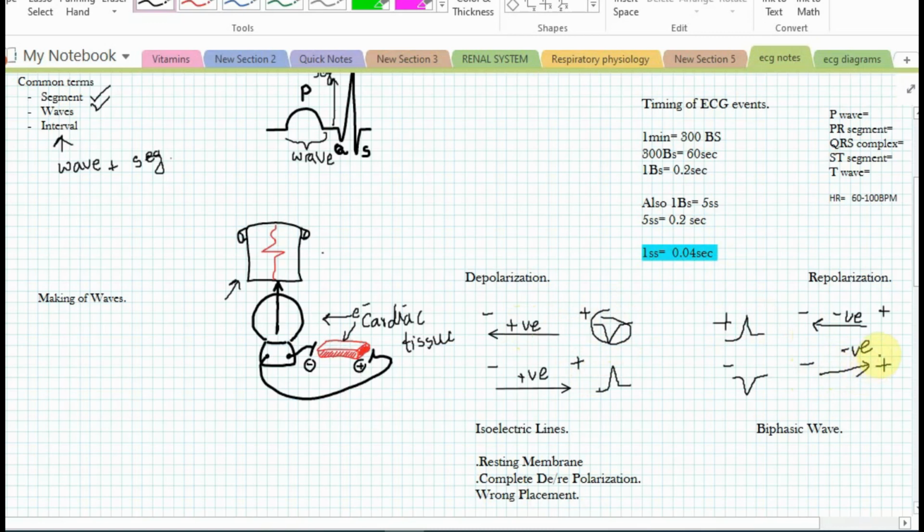The same applies over here. Any negative moving towards positive, or any negative into a positive, will give you a negative, and the opposite sign, positive into positive, gives a positive. Negative into negative will also give a positive. So you can just remember this quickly. This is basically how a wave that you see either moves up or it has to go down.